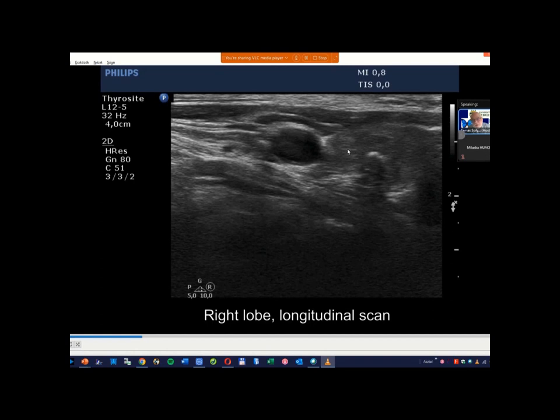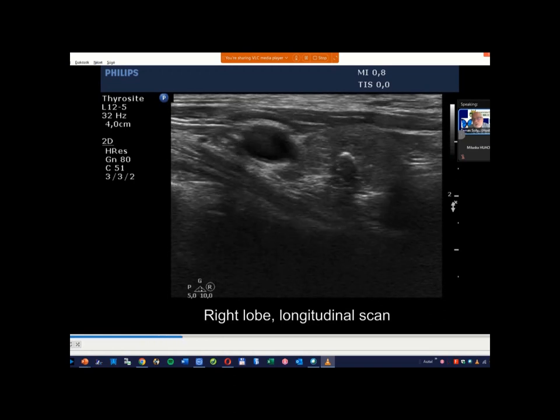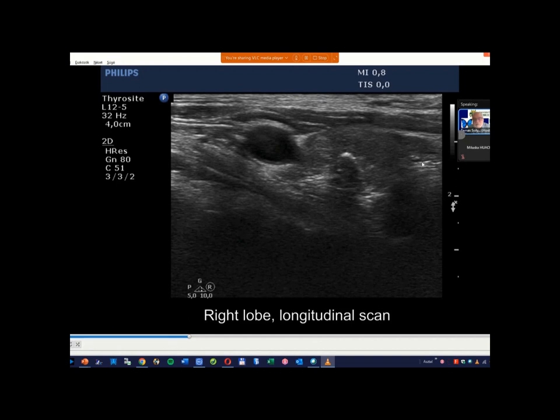be aware. Here is again a similarly not very bright line. This belongs to the normal connective tissue backbone. So these we frequently overlook. Yes, maybe here's a cystic area within this lobe here, a tiny cystic area. It can be back wall figure, but as I mentioned previously, the presence of back wall figure does not influence the malignancy rate. Yes.